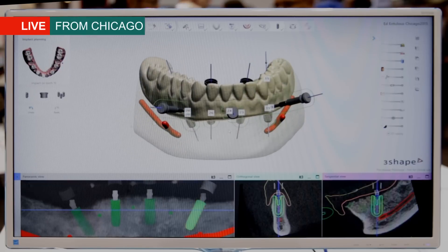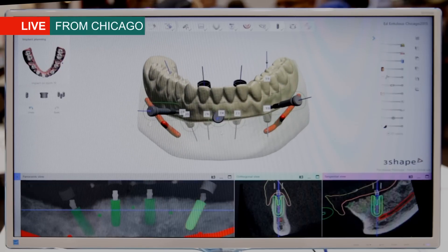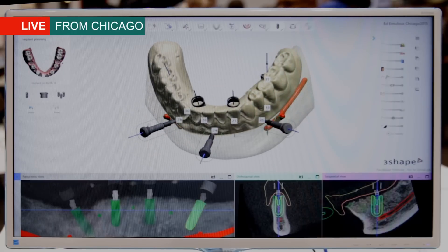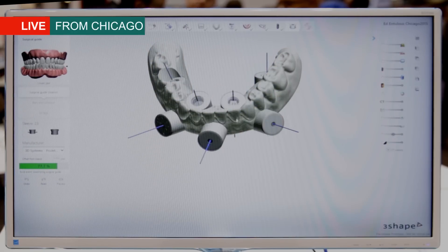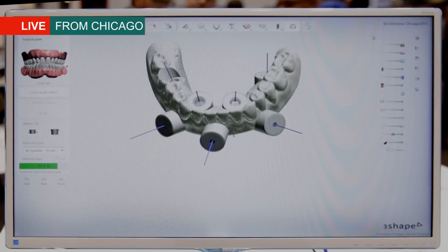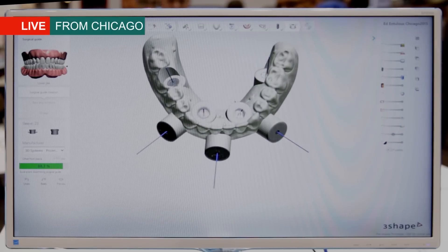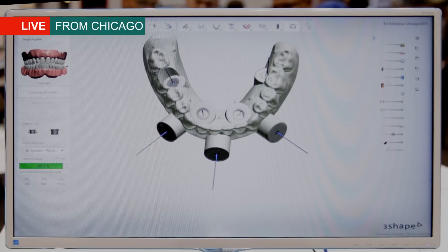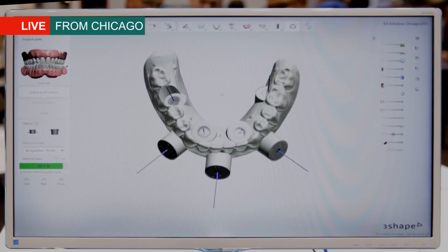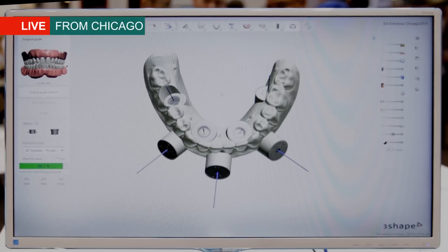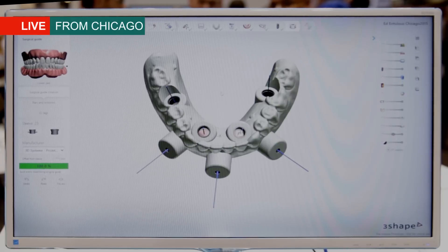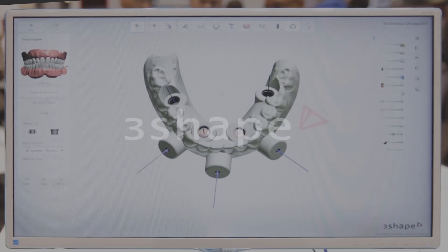When we're happy with our implant planning, we can go ahead and automatically calculate a surgical guide based on the planning. The important factor is of course that we output this design in an open STL format that you can then go ahead and produce on a 3D printer of your choice.